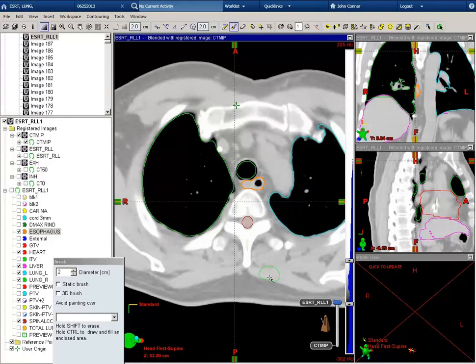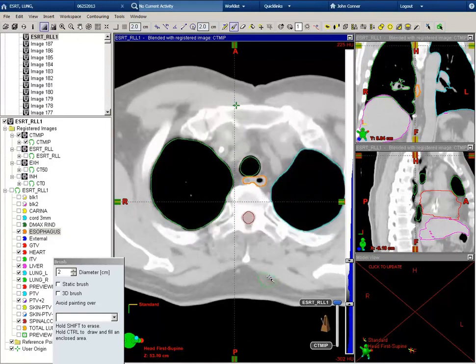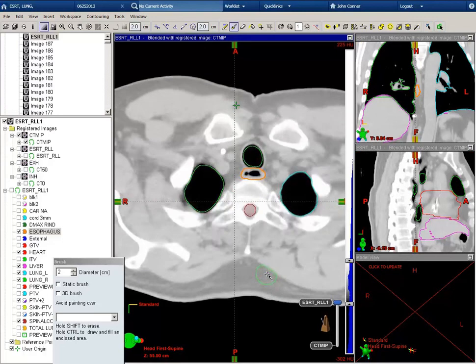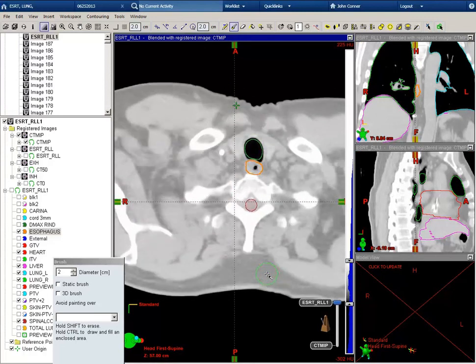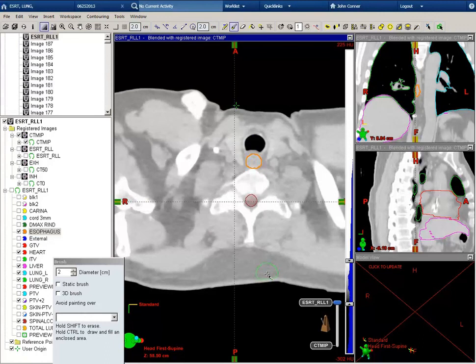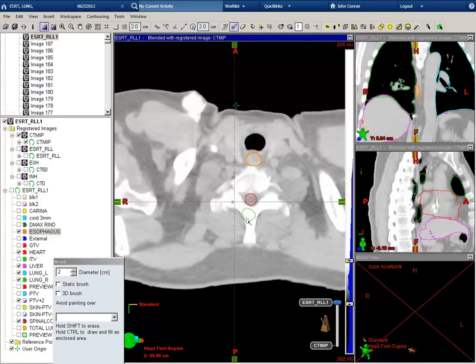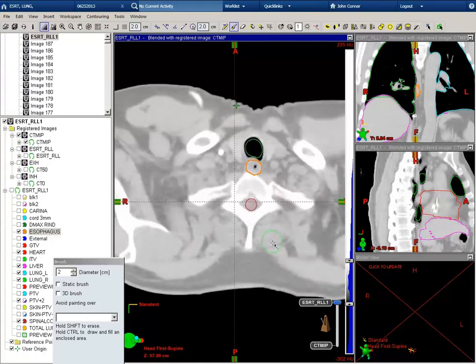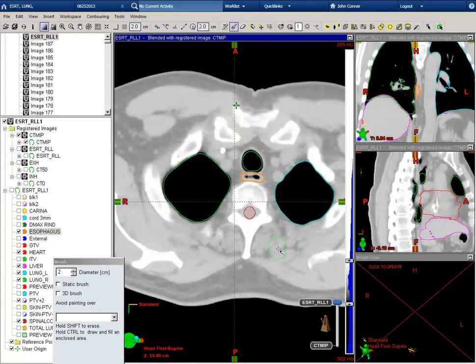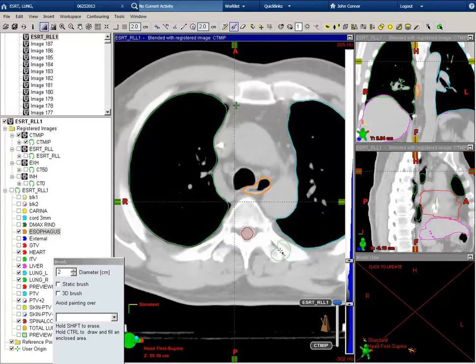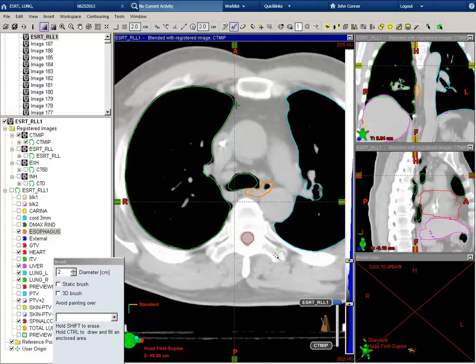We'll continue superiorly to when we first see the esophagus form. Right about here is the last slice of our esophagus. The next contour I want to point out is the spinal cord, here in red. It's denoted as a circle — we don't contour the whole vertebral canal, just a circle of the spinal cord.